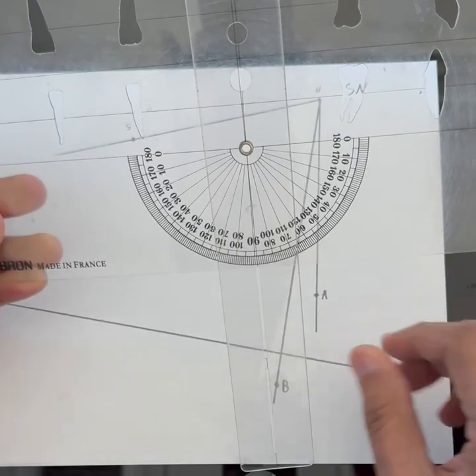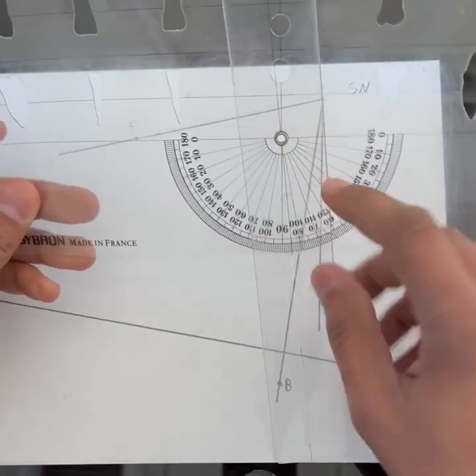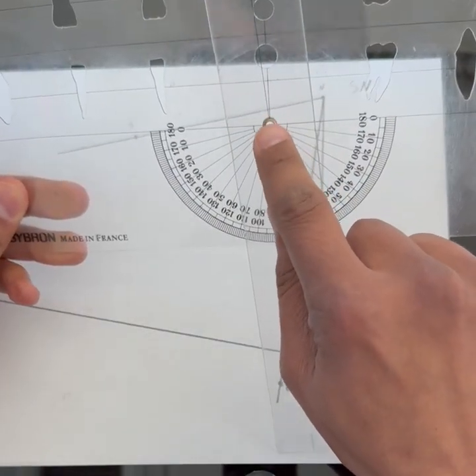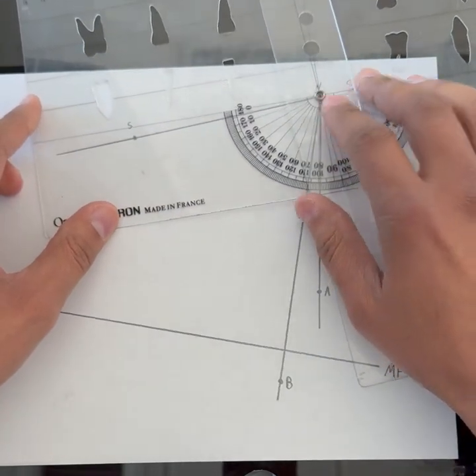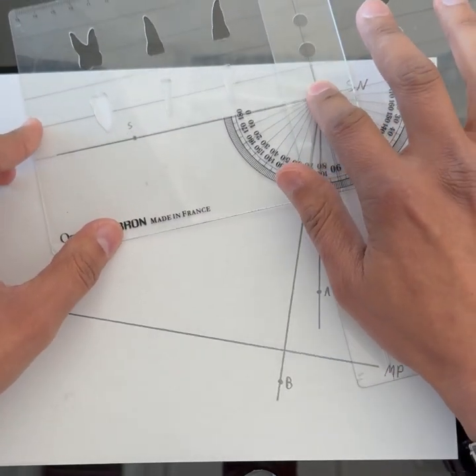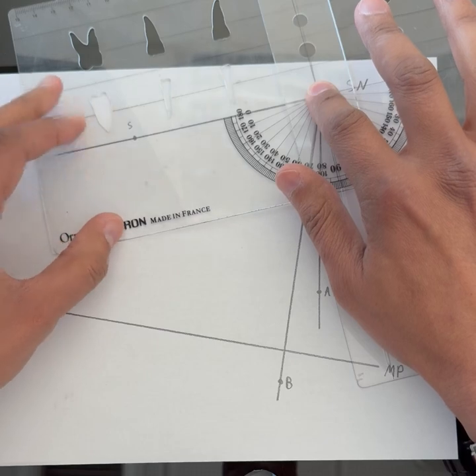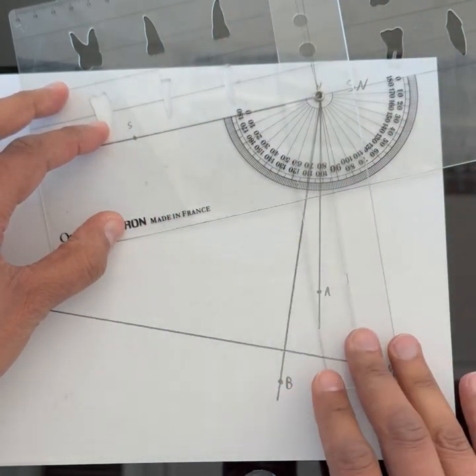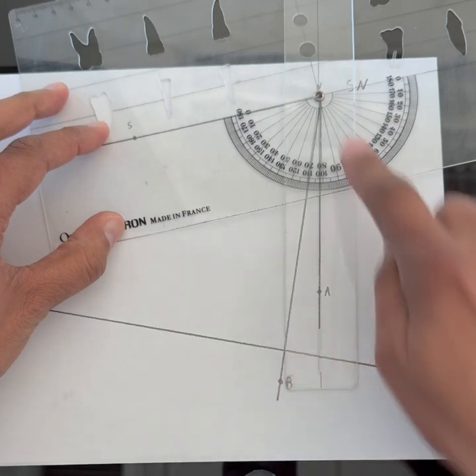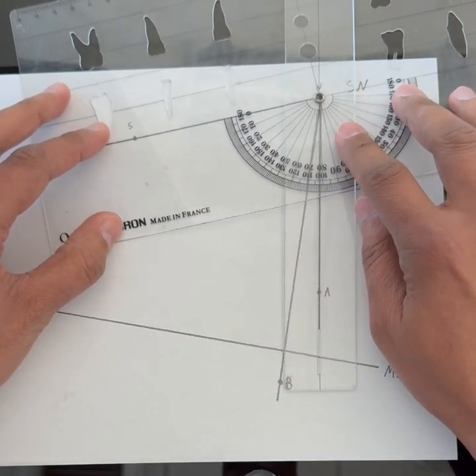To start, you want to place the center of a protractor in the center of the angle you're measuring. You want to make sure that this line aligns with your first line and then this line aligns with the other line of the angle that you're trying to measure.